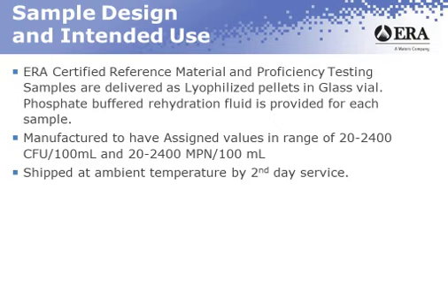So we routinely ship things ground. We ship these all over the world these days. So having a sample that is designed in a way that allows it to be very stable at ambient temperatures is really important in order to supply all the participants an equivalent challenge.